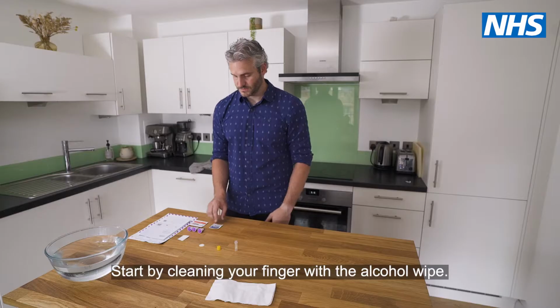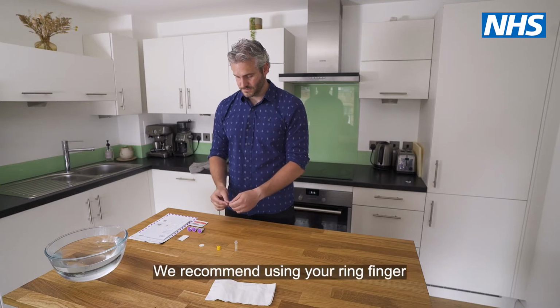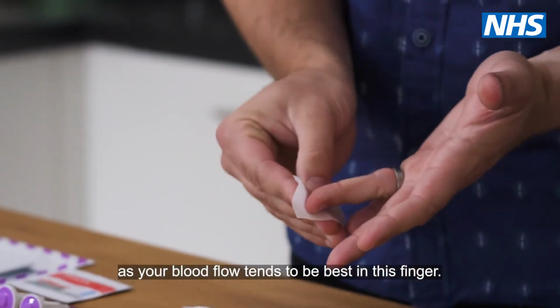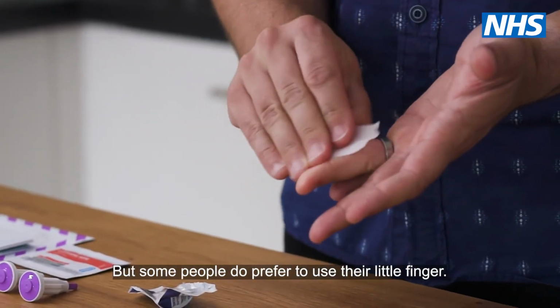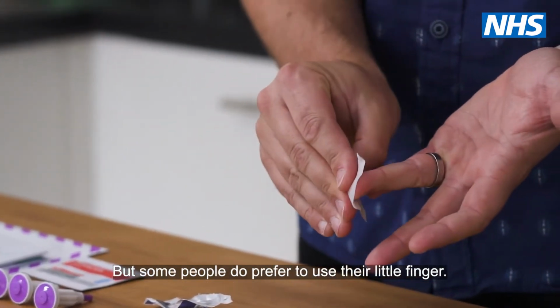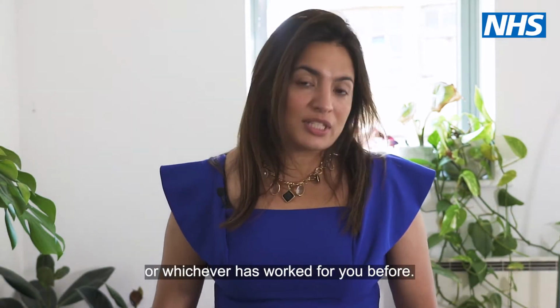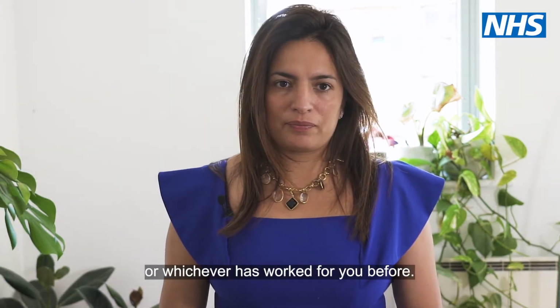Start by cleaning your finger with the alcohol wipe. We recommend using the ring finger as your blood flow tends to be the best in this finger. But some people prefer to use their little finger. Try whichever you're comfortable with or whatever has worked for you before.